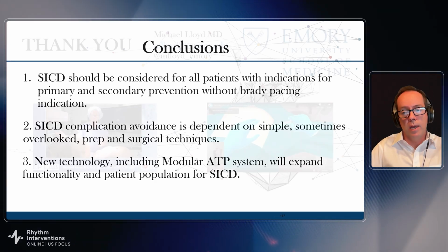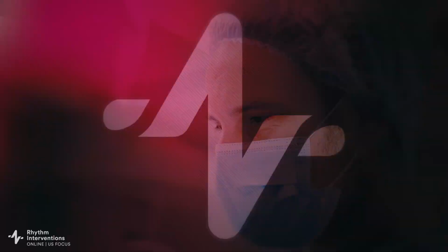So with that, I want to make a plea to our panel: tell me what you do and what you don't do and what you disagree with.